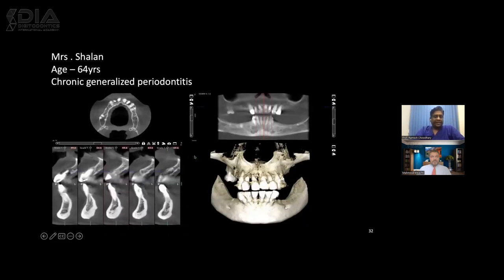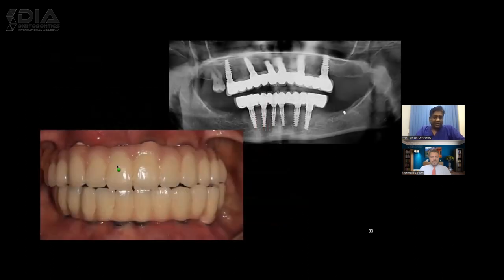Evaluation of digital planning. Of course, we started earlier just with CBCT planning. With CBCT planning, there were no guides. I'm talking about 2010, because in 2011 I got the DTX Studio, which was called Nobel Clinician in those times, and we just used to plan with it. We used to be excited to know the width of the available bone, and the situation of the bone in the cross-section and the profile. And of course, it had given us promising results even in those times.